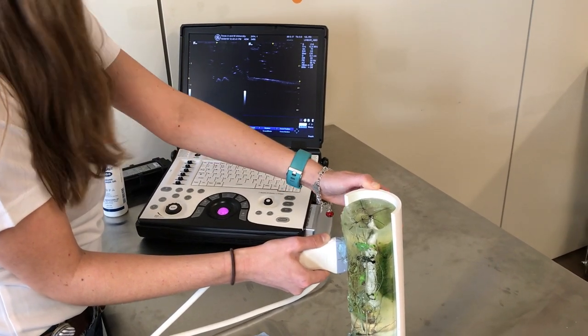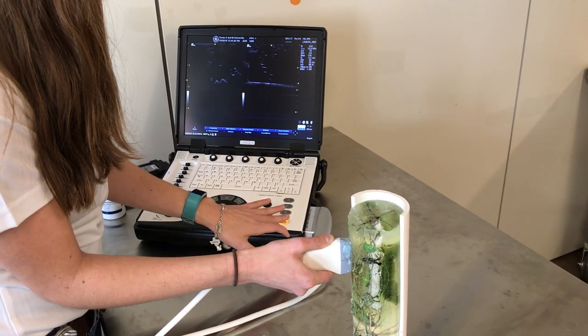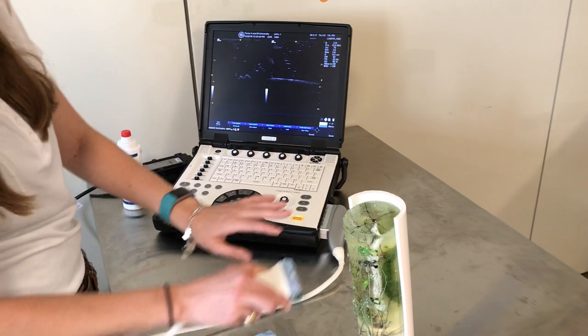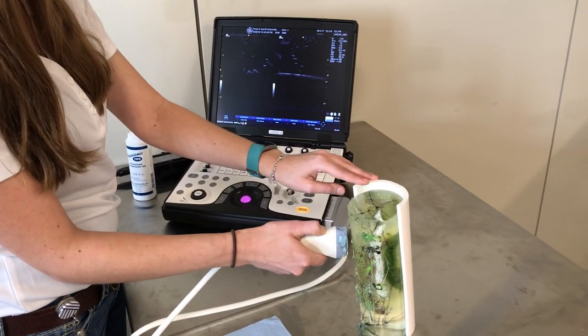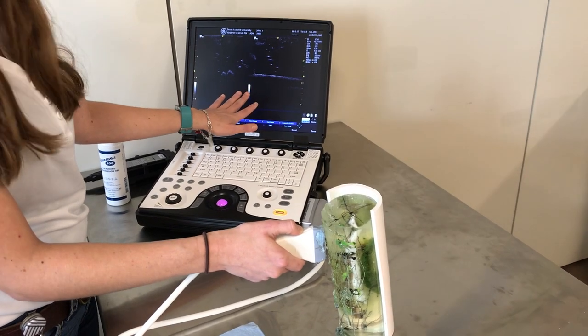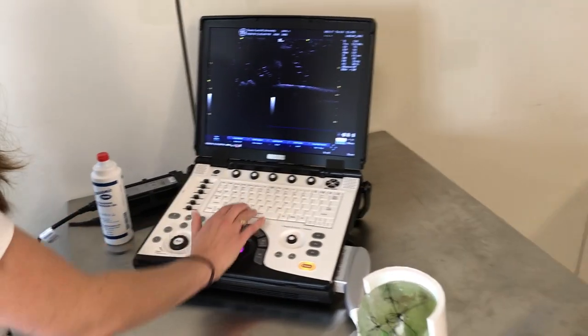When we find an angle we want to take a picture of, we'll do the same thing and freeze the image. Going back to the way my probe was positioned, I want to make sure if anyone else looks at these images, they'll know what's going on. So we'll go to label the images.